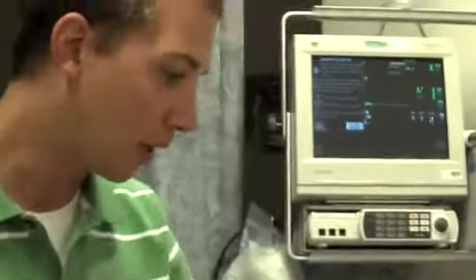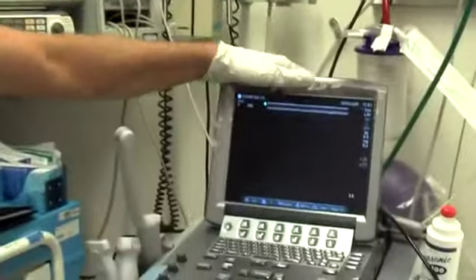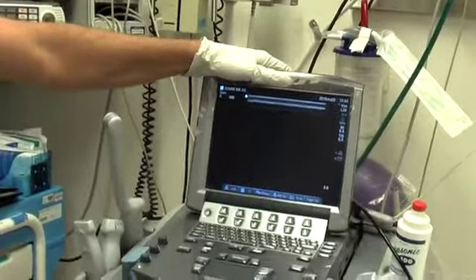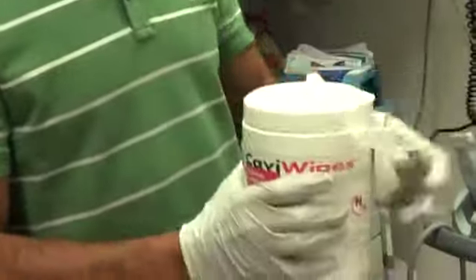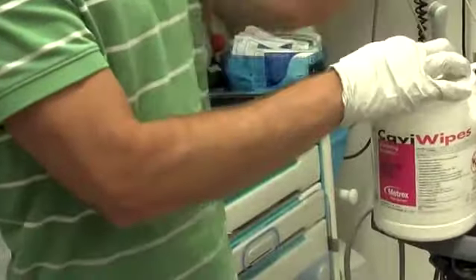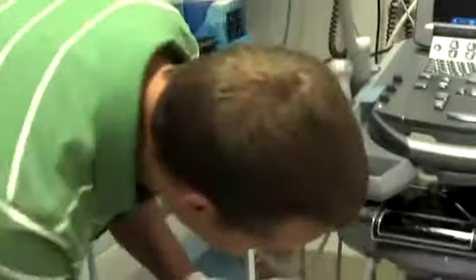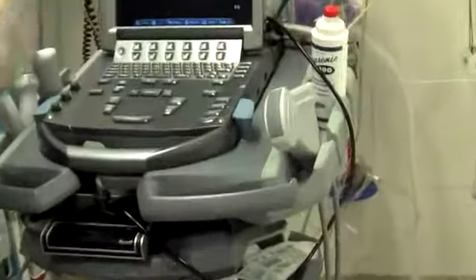Just wanted to speak briefly about cleaning the machine. Before you use the machine on anyone, you should make sure that it's clean. We have these cavi wipes here. Make sure you're wearing gloves when you handle them. And you want to get yourself a wipe. And whichever probe you intend to use, give it a good wipe down and let it dry before you use it. That should also be repeated when you're done, both to clean the gel off the probe and also to disinfect it. You could wipe the keyboard down with one of these cavi wipes as well.